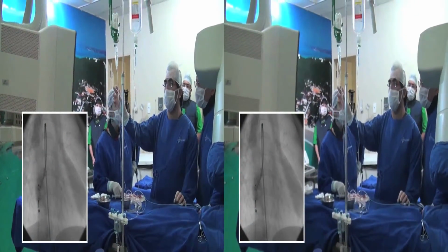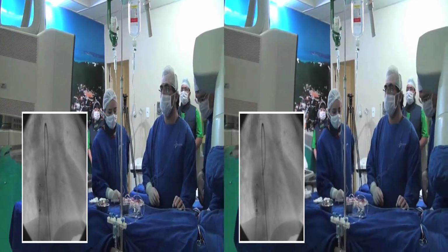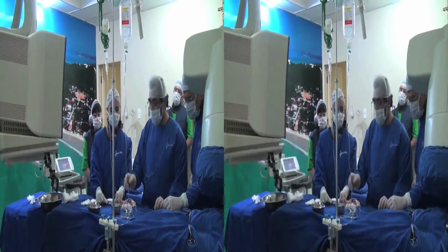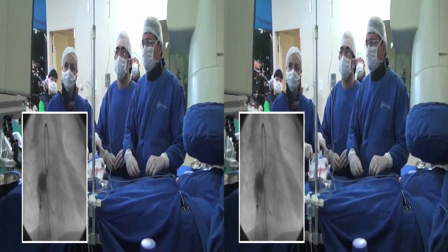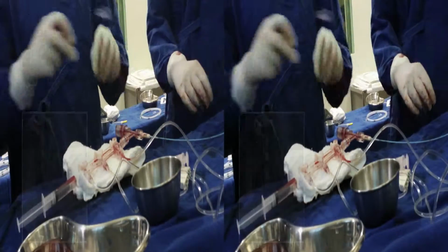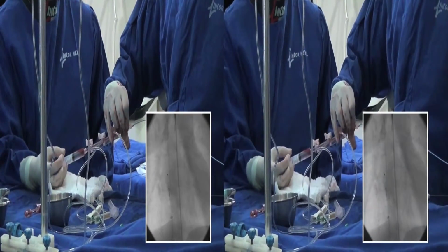In a first technique, we chose to leave this final tab in the right atrium, but noted that there was still contrast passing. Therefore, we repositioned it upward, in the position originally imagined and observed to be the most appropriate. In this image, we see the prosthesis being released and in this other, the prosthesis fully released.